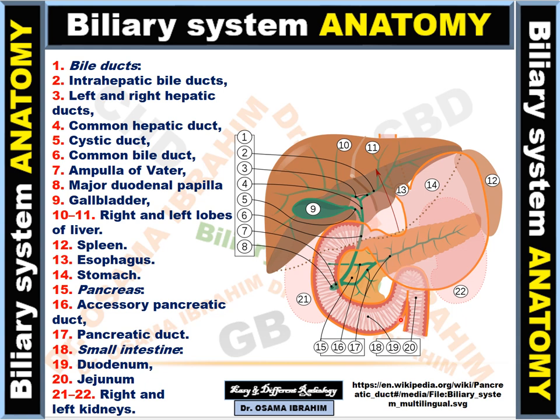This is the duodenum, this is the duodenojejunal junction, and this part is the jejunum. The GI tract segments shown are the esophagus, stomach, first part of the duodenum, second part of the duodenum, third part, and fourth part.